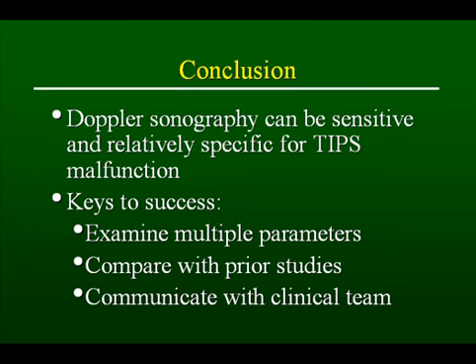In conclusion, Doppler sonography can be a sensitive and relatively specific indicator for TIPS dysfunction. The key to success is that you have to use multiple parameters, at least 8 that I described, compare with prior studies, and communicate with the clinical team.